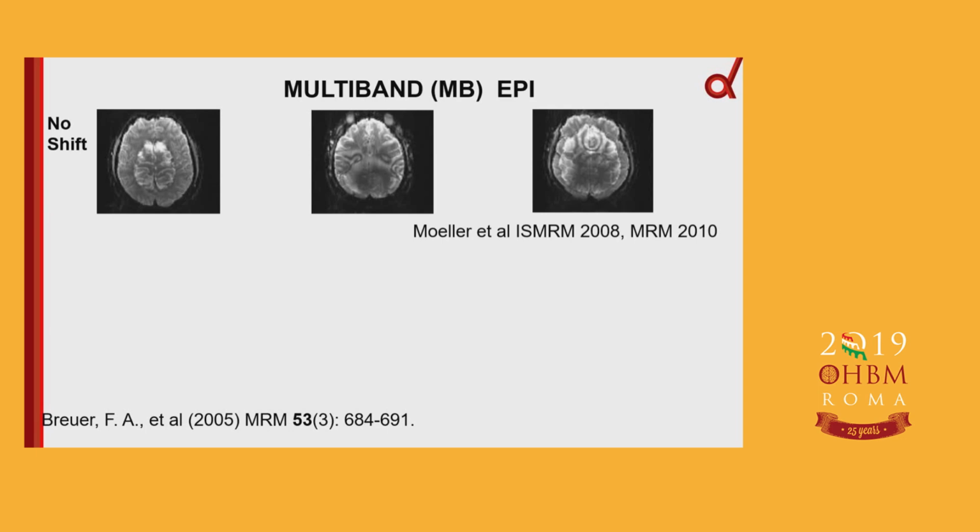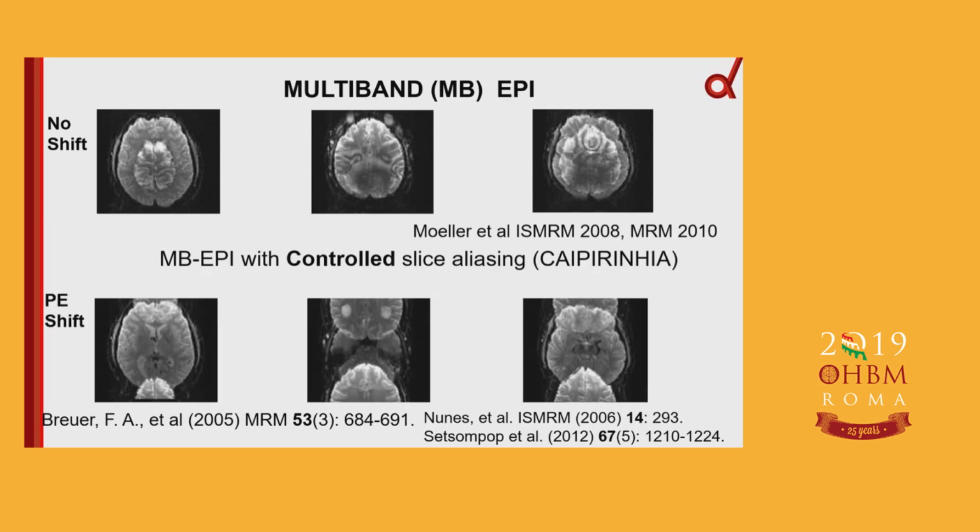And this just gives you a few examples from the literature of how it looks when you're trying to disentangle these ones on the basis of coil sensitivity. You're obviously having a much harder job than if you're trying to disentangle these.